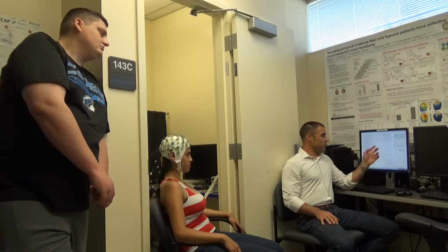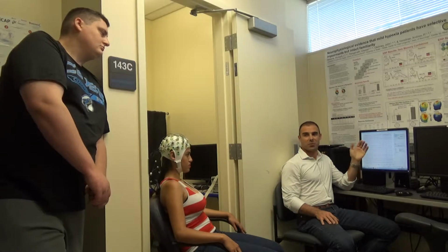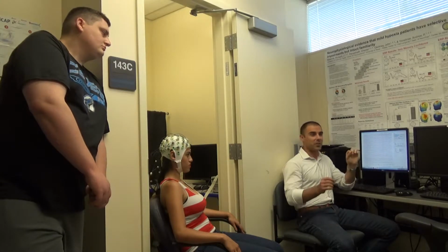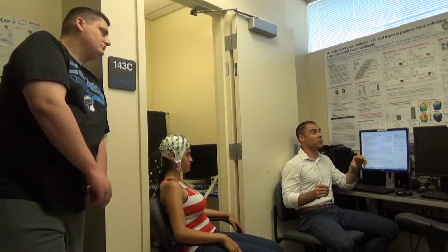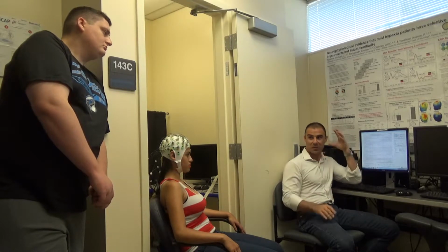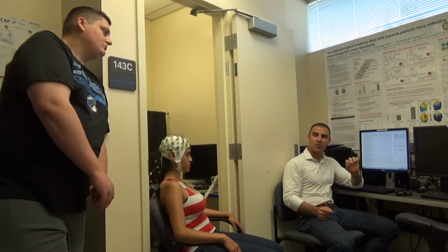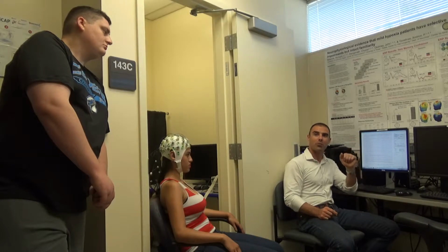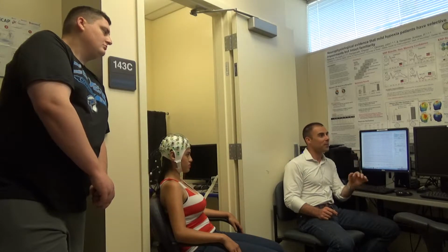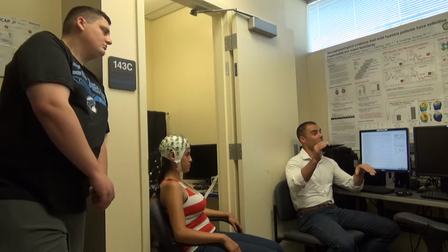You can basically translate the EEG activity that's being recorded to feedback that they're playing on, let's say, a video game. So you might have two little rocket ships racing, and they get feedback on how they're thinking, which changes their brainwaves ever so slightly, that can get the one rocket ship on the left to win. And maybe that's their goal. So you train them to control that activity a little bit so that the left rocket ship wins the race, for example. Or the right one, or vice versa.